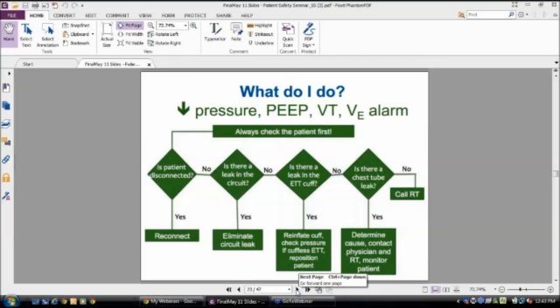This is more of a patient emergency, and you need to determine the causes of the chest tube leak, fix it, and get everybody in the room to help with that. And when in doubt, if you can't solve any of those, call your respiratory therapist.